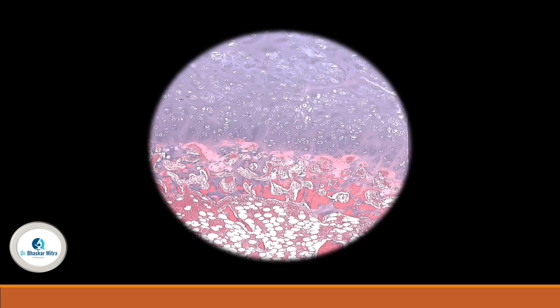Now these are the characteristics in the histology as we discussed previously. It's characteristically showing a hyaline cartilaginous area above and an ossification below. If we see, there are two types of ossification in the bone. One for the flat bones is the intramembranous ossification, and for the long bones is the endochondral ossification. In the endochondral ossification, there is a cartilaginous scaffold which gradually gets ossified and forms a bone.